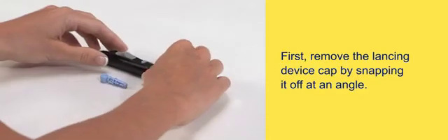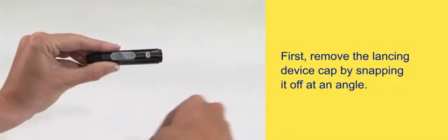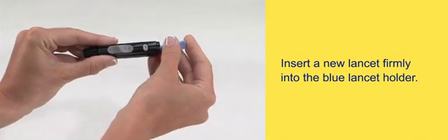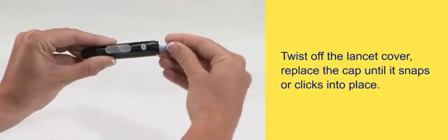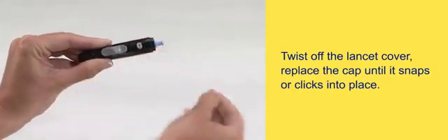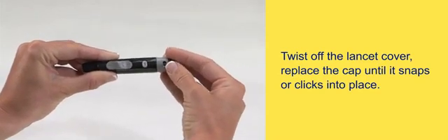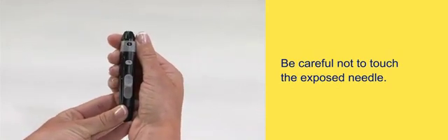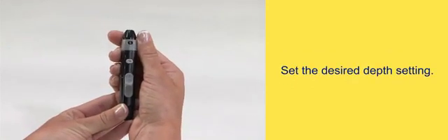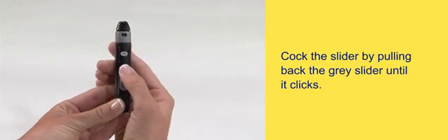First, remove the lancing device cap by snapping it off at an angle. Insert a new lancet firmly into the blue lancet holder. Twist off the lancet cover. Replace the cap until it snaps or clicks into place. Be careful not to touch the exposed needle. Set the desired depth setting. Cock the slider by pulling back the gray slider until it clicks.